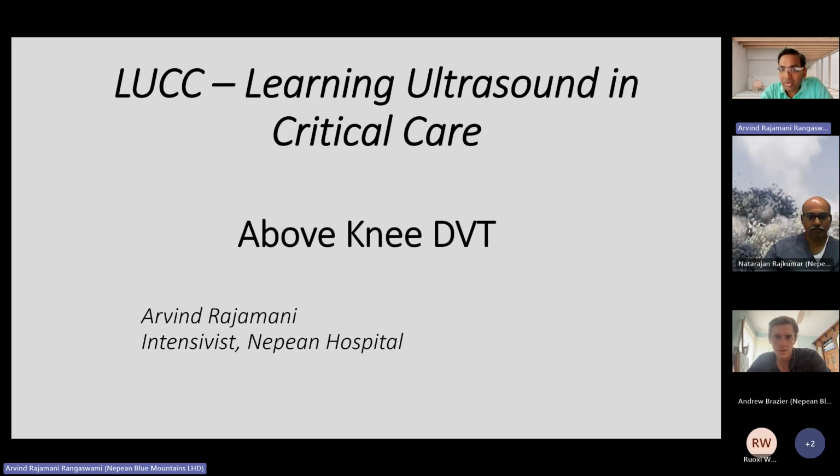Today's session, I'm going to do vascular ultrasound, focusing mainly on above knee DVT.